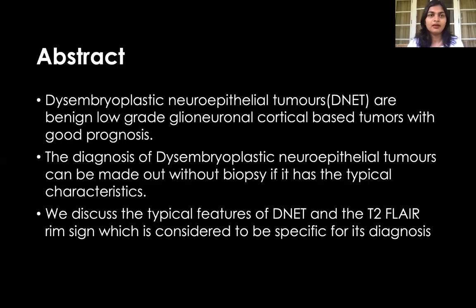Abstract. Dysembryoplastic neuroepithelial tumors are benign low-grade glioneuronal cortical-based tumors with good prognosis. The diagnosis of dysembryoplastic neuroepithelial tumors can be made without biopsy if it has the typical characteristics. We discuss the typical features of DNET and the T2 FLAIR rim sign, which is considered to be specific for its diagnosis.